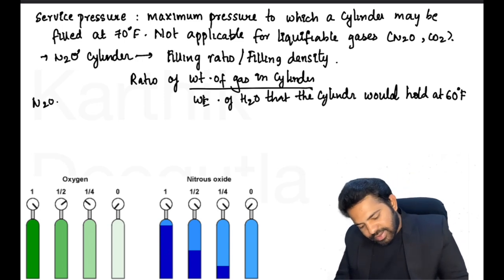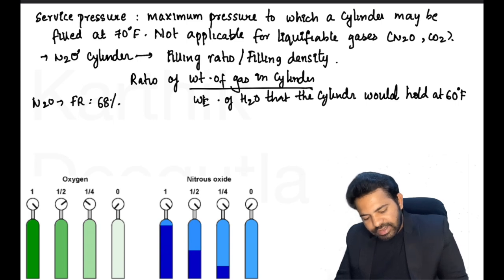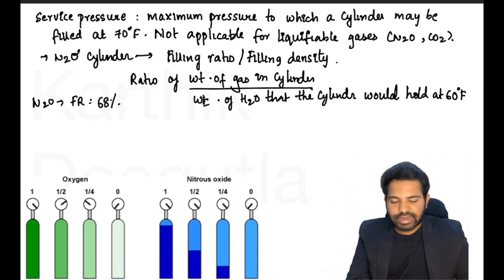And for nitrous oxide, the filling ratio is 68%.